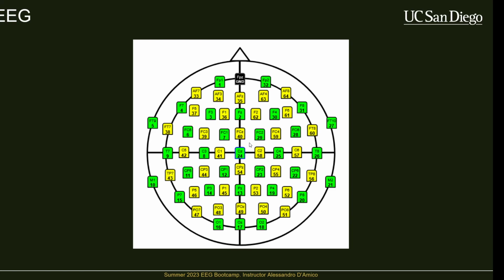this standardized location makes it very useful to discuss EEG research with other researchers that might not be from your university or even your country. You don't want to say, oh, I see this activity is maximal in frontal areas. It's much faster to say I see maximum activity at FZ or CZ or PZ, or take the mastoid references, or you see SSVEP and other visual activity more present on the occipital electrodes like O1, OZ, O2. It just gives us a standardized way of communicating where on the scalp we're talking about.